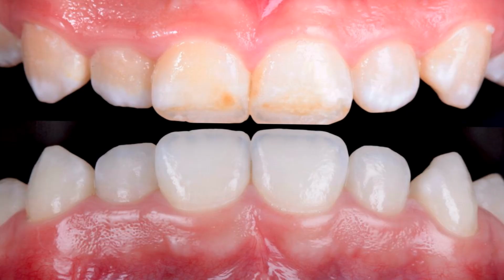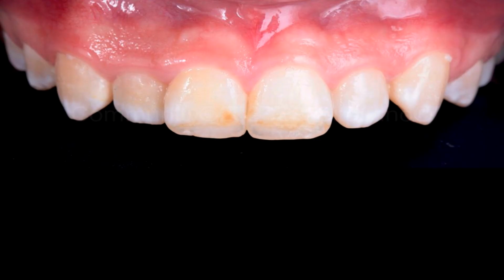So we have this case about the ICON technique, before and after. We will discuss this case in detail, how the technique was done. Firstly, we have this case with a multichromatic spot in the enamel of a patient.